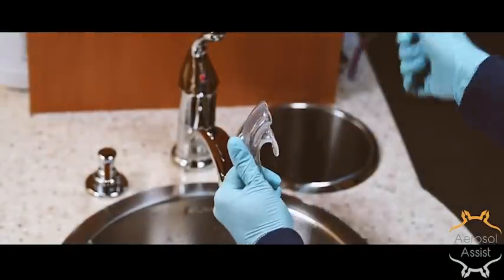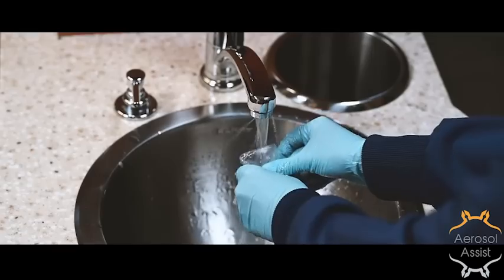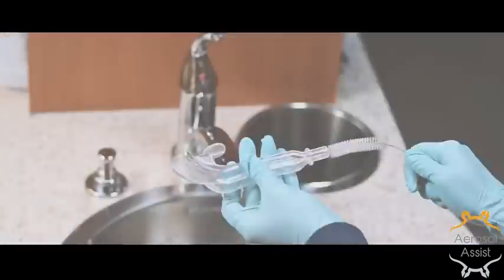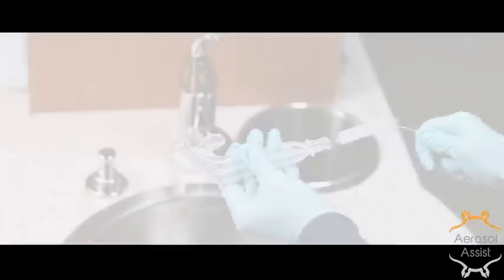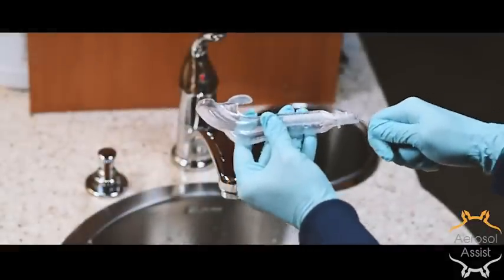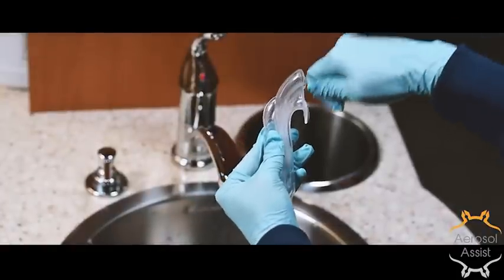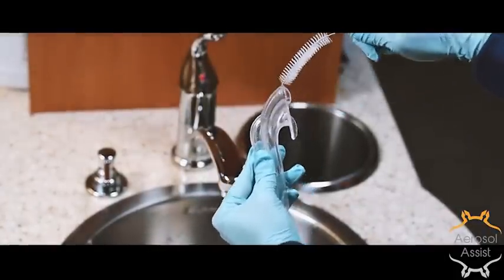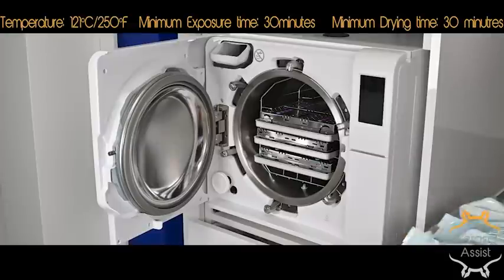After each use, the saliva ejector is discarded. The Aerosol Assist is then rinsed internally and externally to flush out any debris. The HVE port has 2 internal channels that can be cleaned with a standard brush. The aerosol port has access to those same channels and should be cleaned as well. After rinsing, they can be ultrasonically cleaned in an enzymatic bath and then placed in standard sterilization pouches.